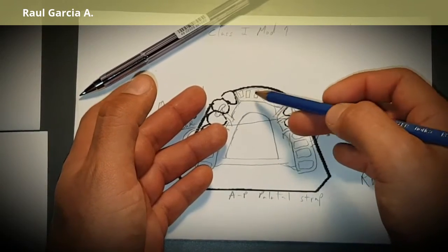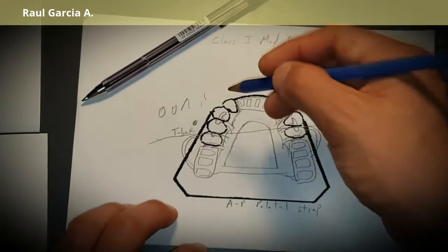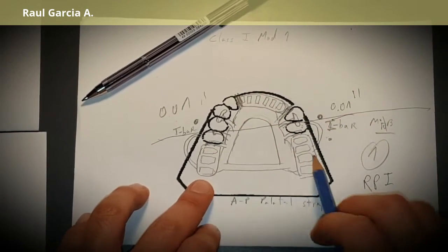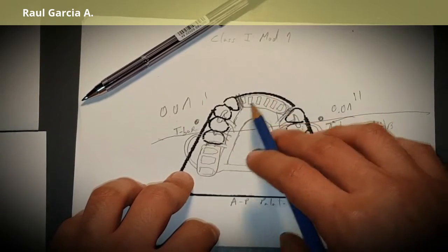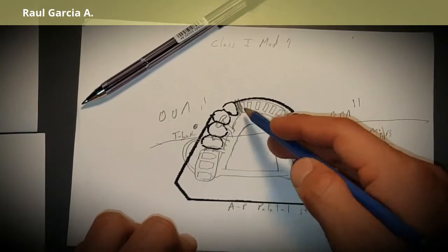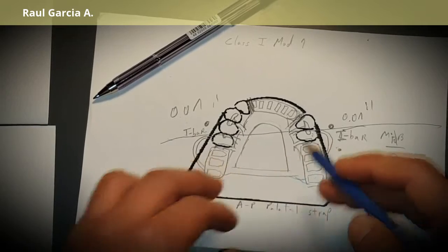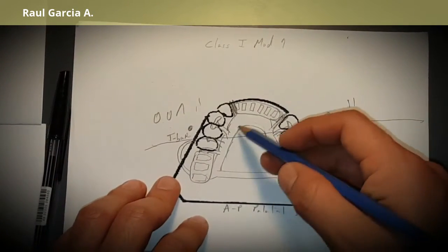For the front area, we're only missing two or three teeth, so the forces there are minimal. A guiding plane on the lateral incisor and a guiding plane on the mesial of the canine will do the job. Then we draw the open lattice mesh for the free-end saddle areas and decide on minor connectors — always placing guiding planes next to saddle areas.